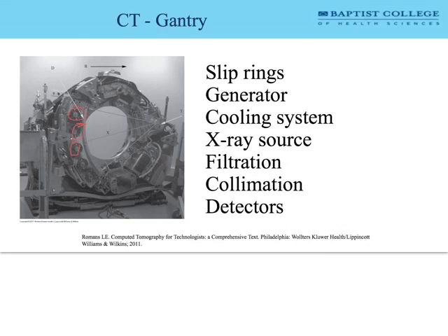Our detectors, we use detectors to collect information, and a lot of times we use the terms interchangeably, but a detector is like a single detector element.